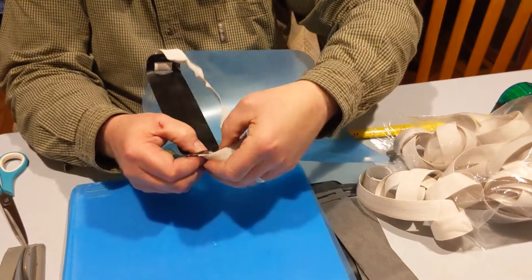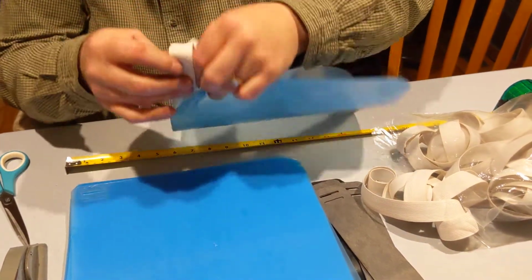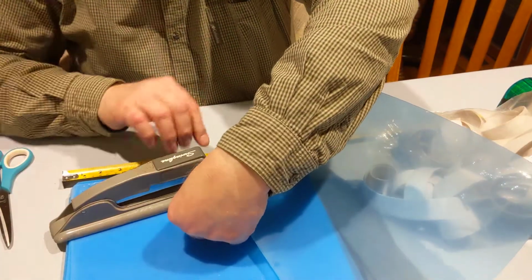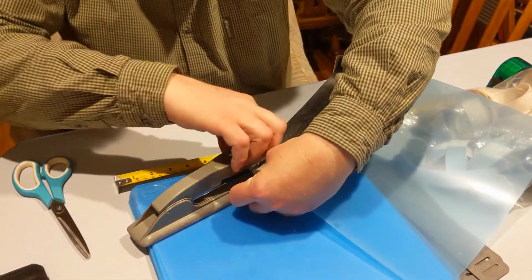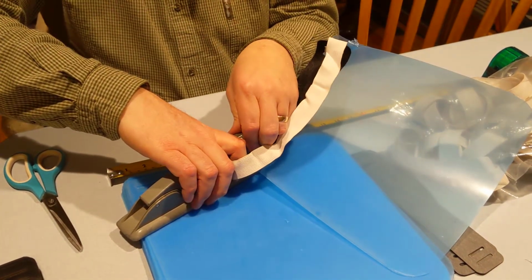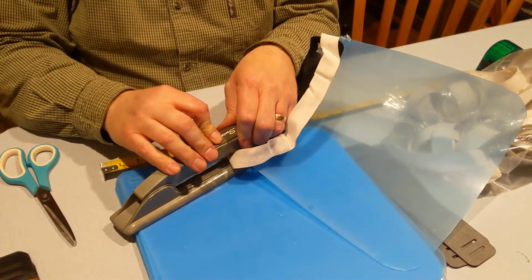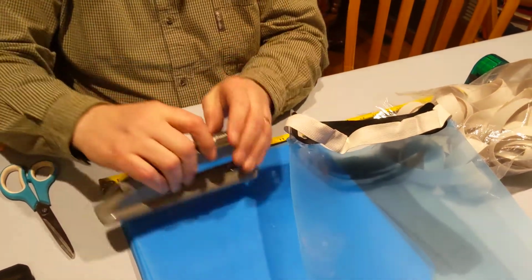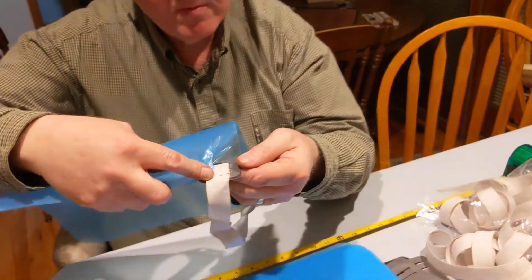You can tell it does hold quite well, so I'll try it again, checking my alignment is okay, putting the stapler here and then bringing it in, positioning it carefully. And you can try, depending upon the stapler you use, it may be fine to press firmly and gently, or with a good stapler such as a Swingline, it may also work to give it a firm press. And now this time the staple closed.